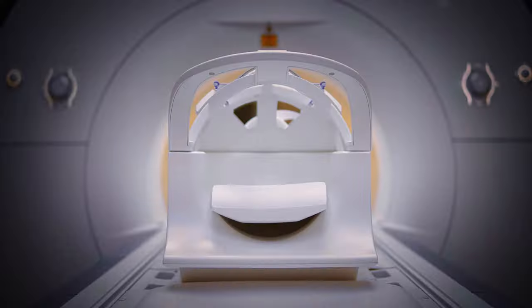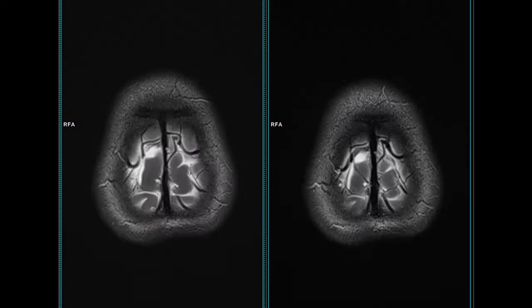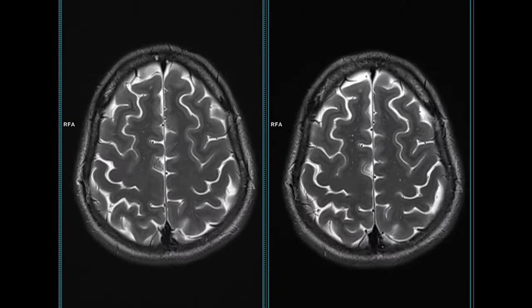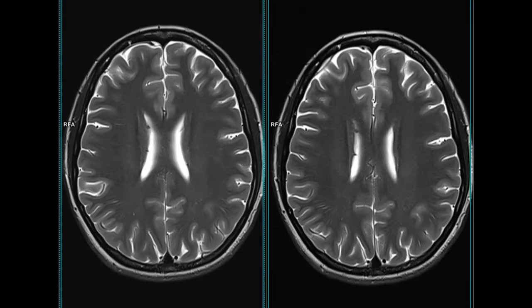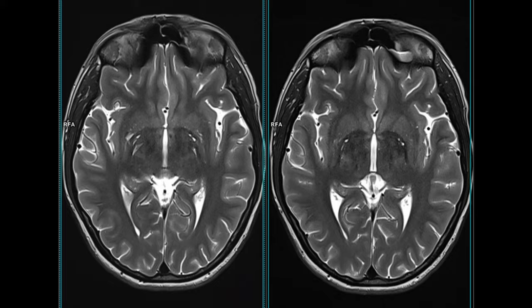Hello everyone, welcome back for another video. Today we're going to talk about the head-neck 20 channel coil and try to think outside the box for difficult cases. Can you see the difference between these two images? It's very difficult, right? Believe me, the setups for these two images are totally different — stick around and I will show you.